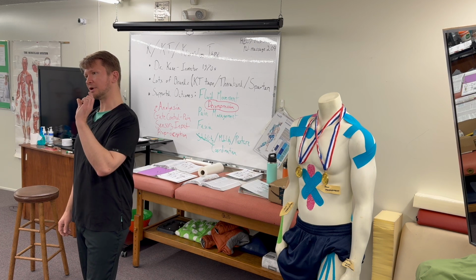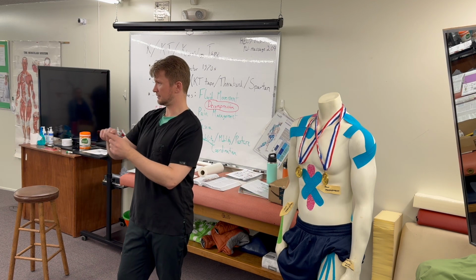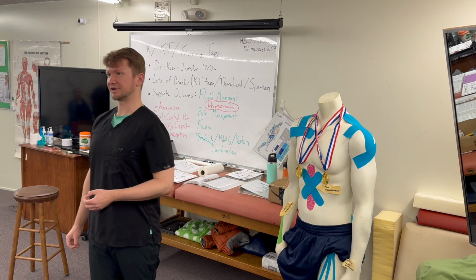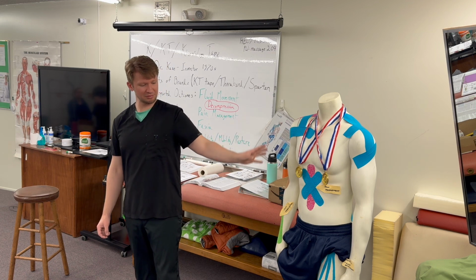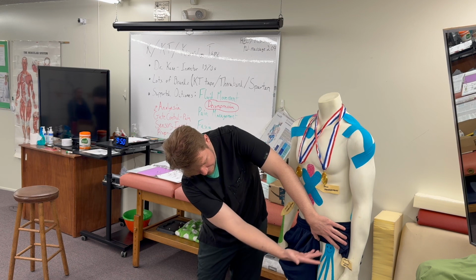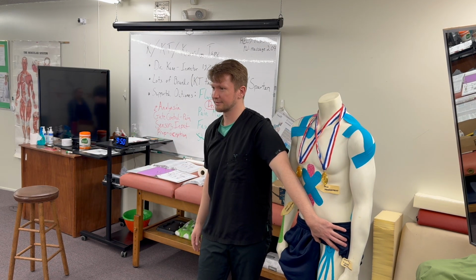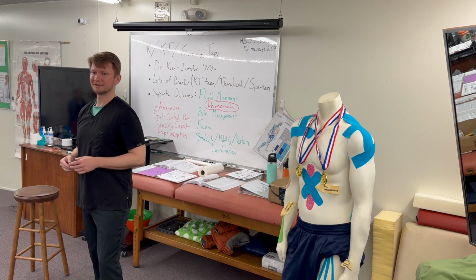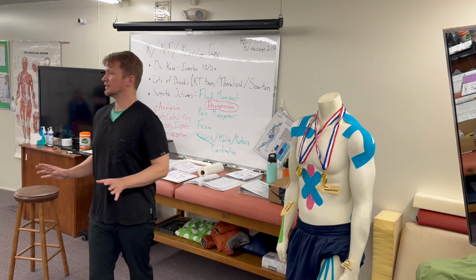So you can talk about pain control if we're seeing some kind of stagnated fluid related to the symptomatic area. Or it's just a good thing for lymph drain. It's really, really good for lymph drain, because now, and once we practice it, that's this one down here. I call it the quadrupus. So 4 tentacles, it's easier than making a bunch of small ones. I'll show there's lots of ways to cut the tape. You can get really fancy with it and let your inner artist out.